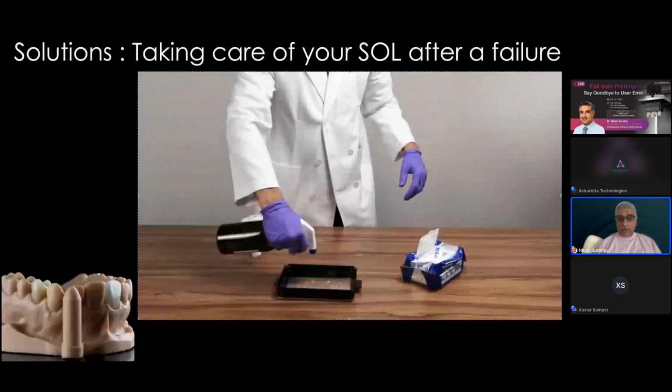I tend to follow up on the wet alcohol wipes with dry tissue in order to take out any smudges from that film, make sure it's absolutely clean. And then I'm ready to start printing again.